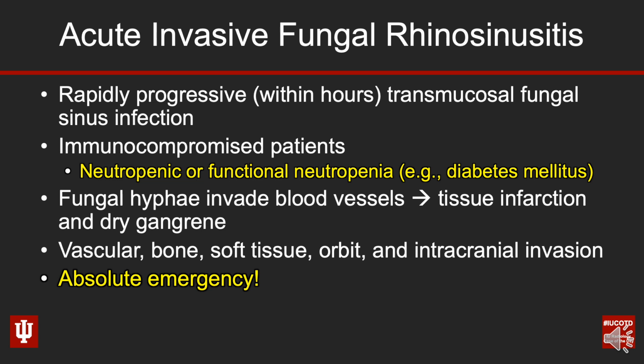And this is, as I've hopefully tried to make the case for so far, but I'll say it again, this is absolutely an emergency. You need to be having a conversation with a referring doc before you ever finish dictating the study. This is one that you don't let the sun go down on. You don't delay any time whatsoever in handing off these critical findings.